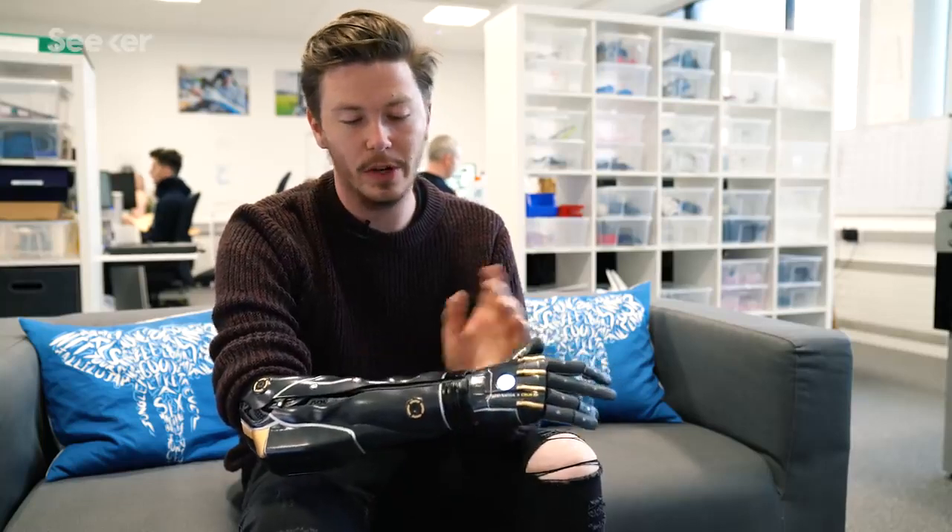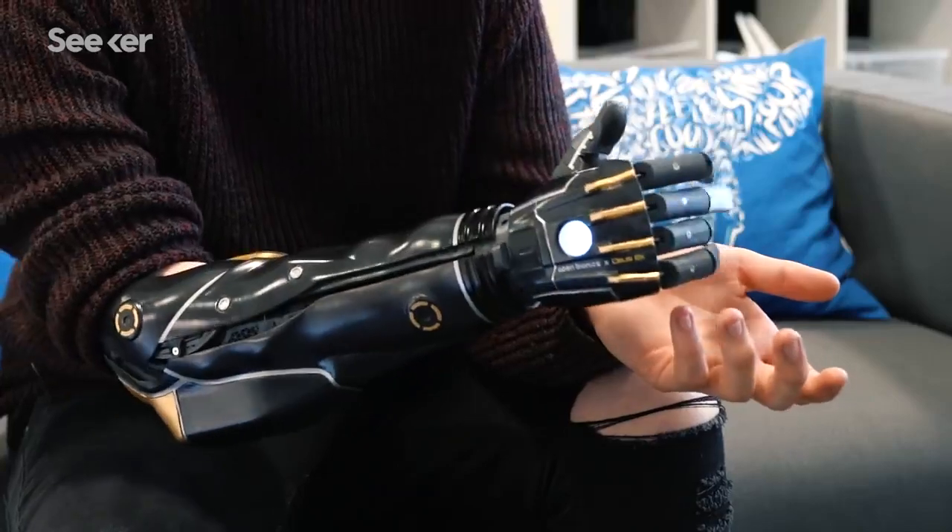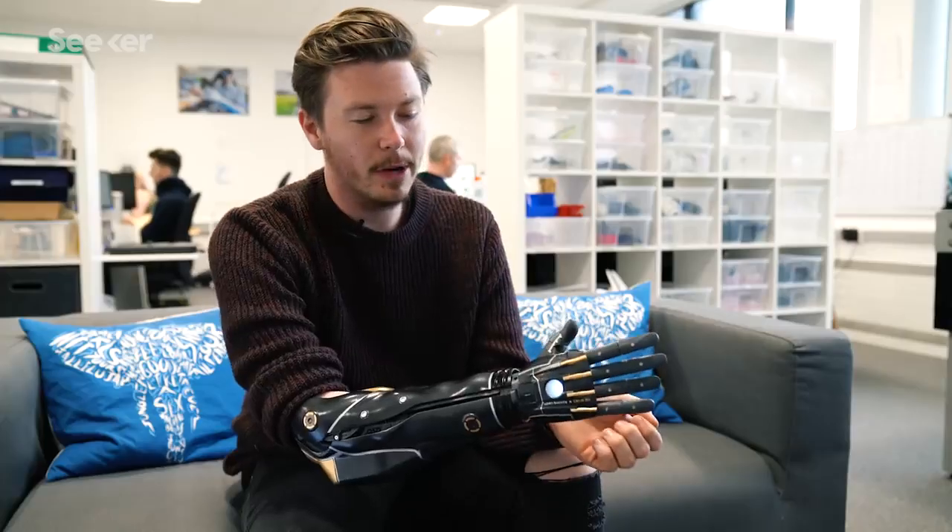These are the Deus Ex panels, which you can see look really nice. With this arm I'm able to open and close — as you can see, that tenses my muscles.